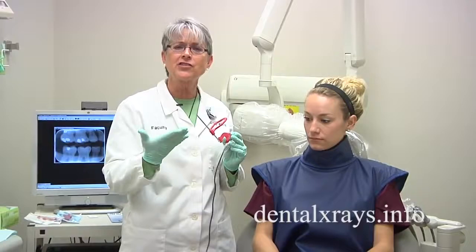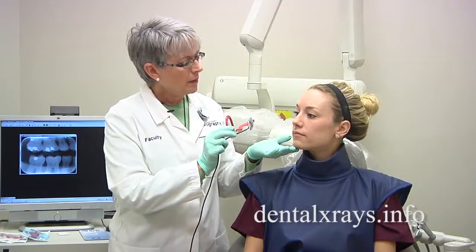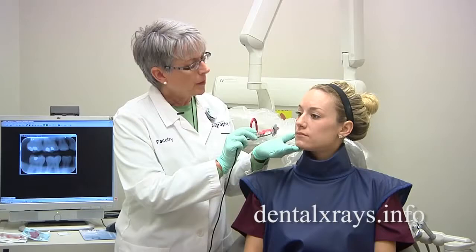Sometimes it's just hard to get that distal of the canine because the sensors are a little thicker and a little harder. What happens is that when you try to put the sensor close to the patient's tooth, you're not going to get a good view — it's not going to be close enough.